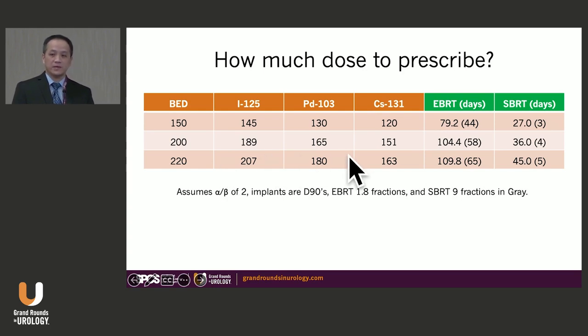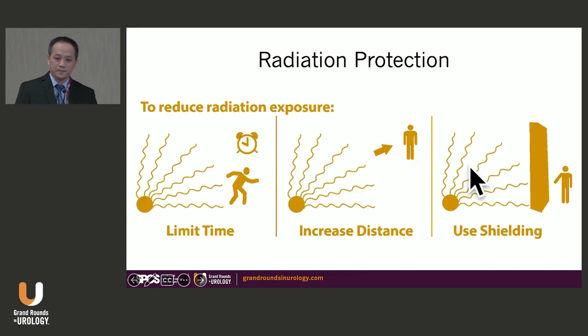Stone's result, when you use the brachy seed, you would notice the activity and the seed number actually is not increased. You are not putting in 40% more seed, or calling the company to order 40% more seed. Because of the nature of physics, the seed just gives you a much higher dose in a shorter distance. So that's why I want to bring this up here.